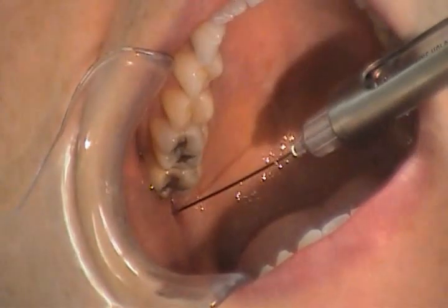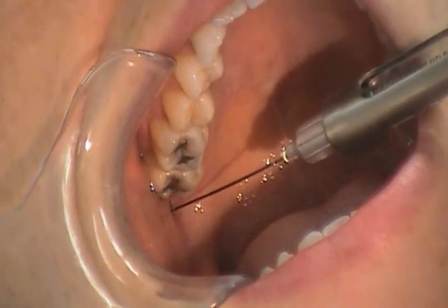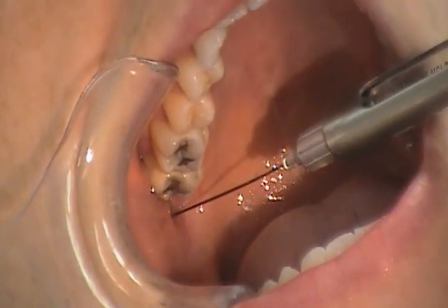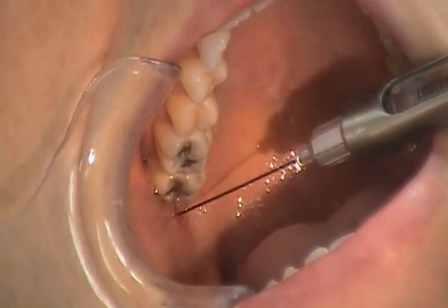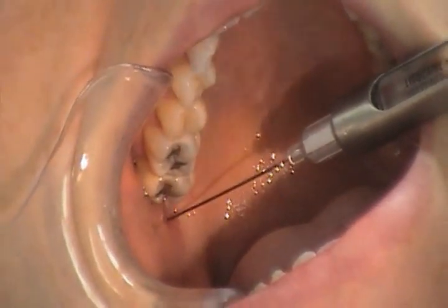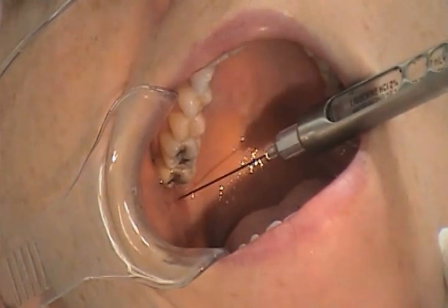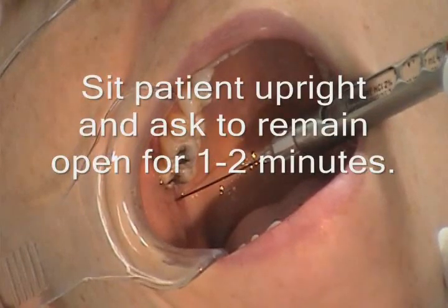As normal, you would prepare your tissues at the site of penetration by drying with gauze and applying topical anesthetic. Slowly advance the needle until bone is contacted. Bone contacted is the neck of the condyle. The average depth of penetration is 25 millimeters. If bone is not contacted, withdraw the needle slightly and redirect — move the barrel of the syringe somewhat more distally, thereby angulating the needle tip anteriorly, and re-advance until bony contact is made. At this point, withdraw the needle approximately one millimeter, aspirate, and inject 1.8 milliliters over 60 to 90 seconds.